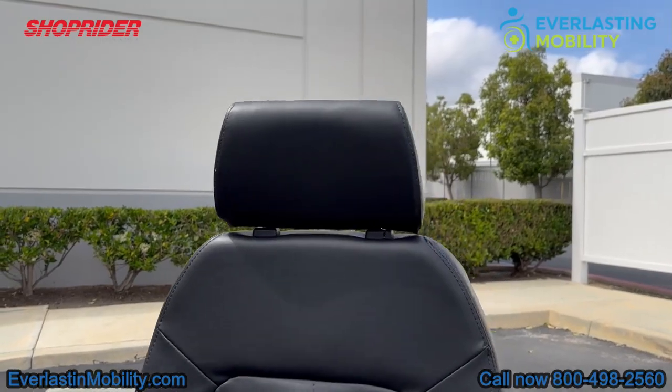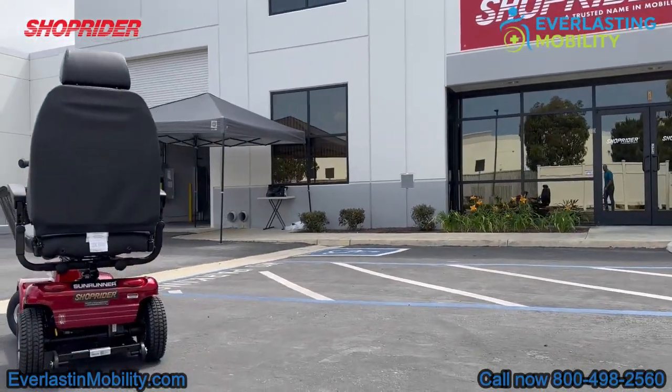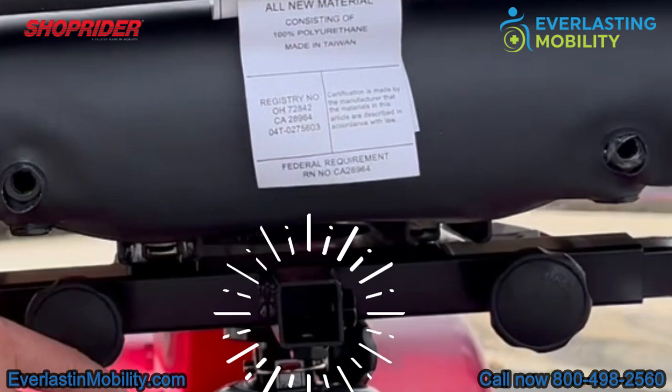The seat on the Sunrunner is a high-back deluxe captain seat that is very comfortable, and if you're a taller rider, the headrest is also adjustable. This is the universal accessory hitch, so you can add things to the back of the scooter, like a rear basket or an oxygen tank holder. Just go to our product page to see which accessories are available.